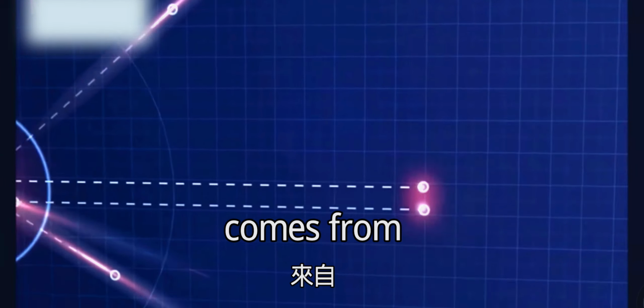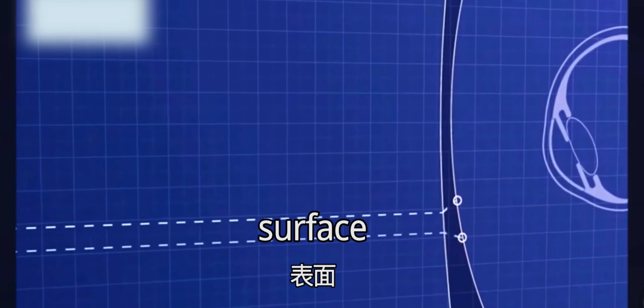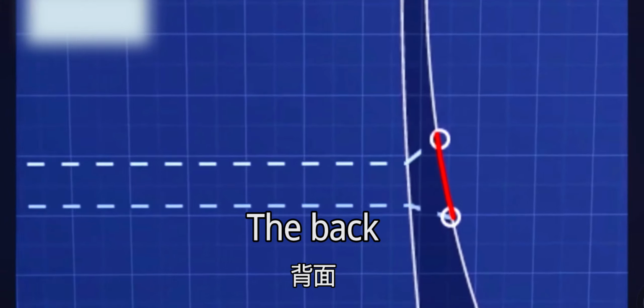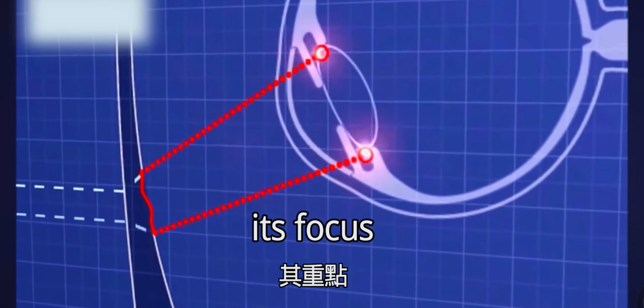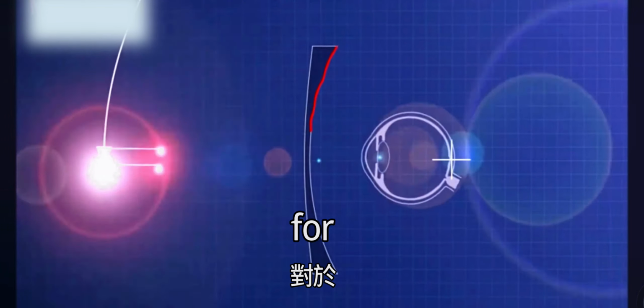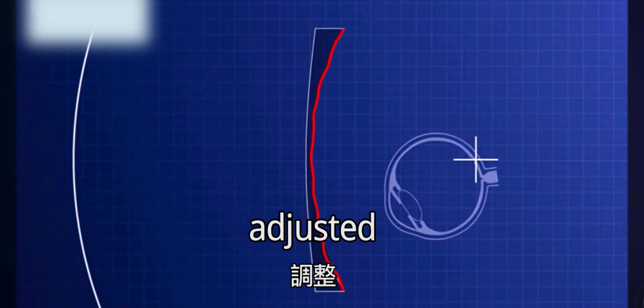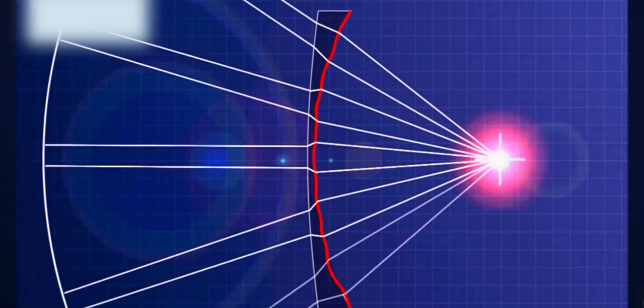This beam comes from the outer environment, refracts on the front and then back surface of the lens. The back surface is modified using this refraction so that the beam changes its focus to the center of the retina, the fovea. This procedure is repeated for every direction of sight until the entire back surface of the lens is adjusted, and all simulated beams focus in the fovea.